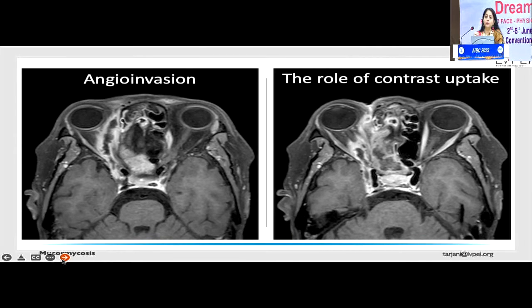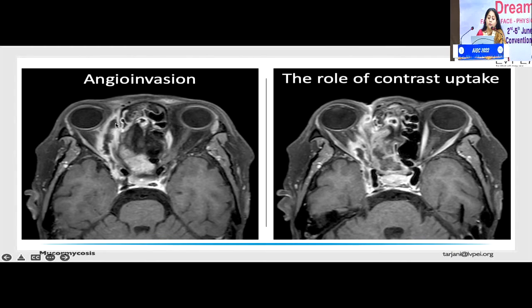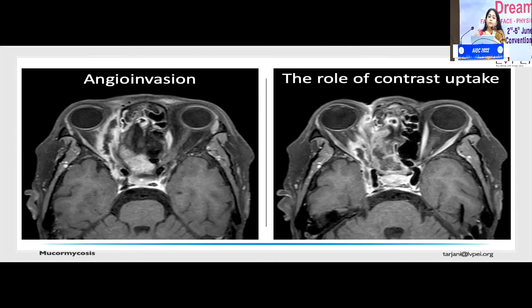Mucor hyphae are known to be angioinvasive — they can enter blood vessels, produce necrosis, block the vessels, so you obviously cannot see contrast. This is the classic pathognomonic feature of mucor. You see the superior ophthalmic vein here: the surrounding wall is all white and taking up contrast, but the actual lumen is infiltrated by fungal hyphae and appears black. This is angioinvasion, and this factor can only be picked up if you have a contrast scan. So we deduce that you need an MRI, fat-suppressed sequences, and contrast enhancement to pick up the disease very well.